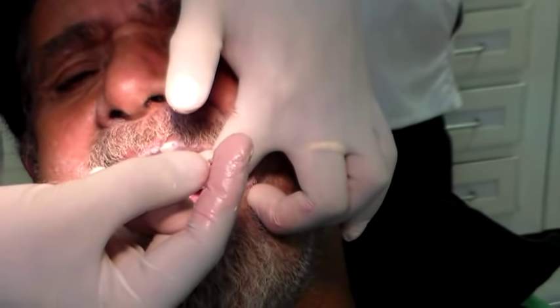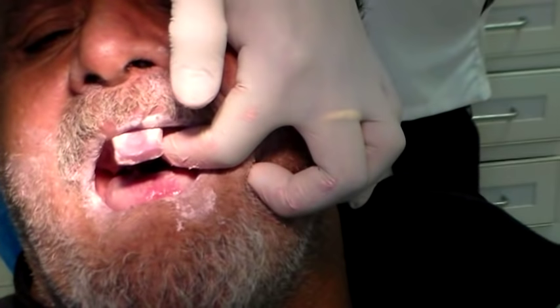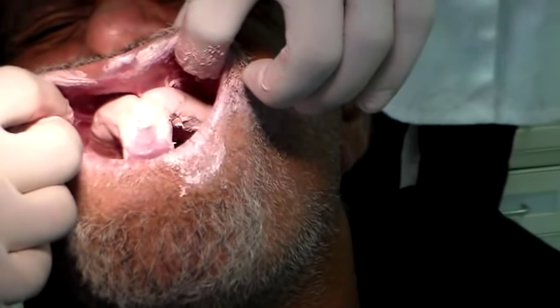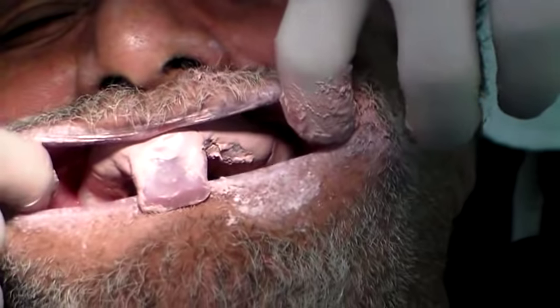I can make the material into a ball — this is the easy way to know it has set. From the old mix you can check that. You can see all my borders.